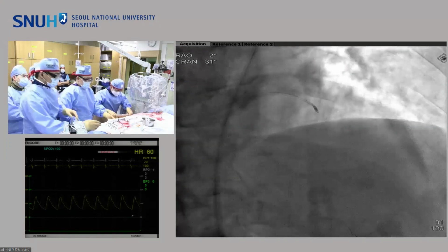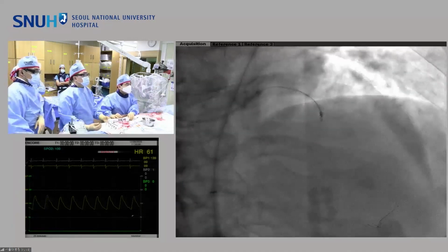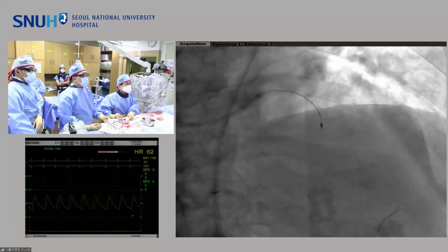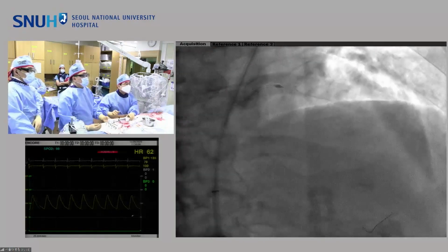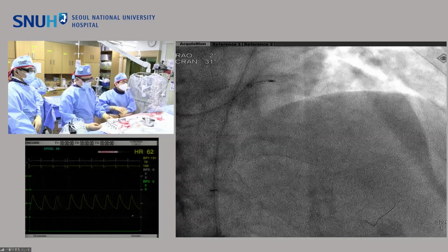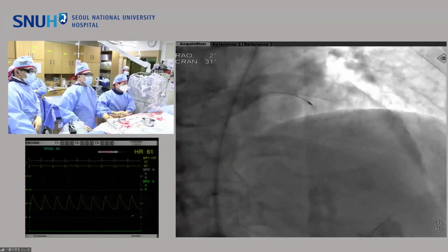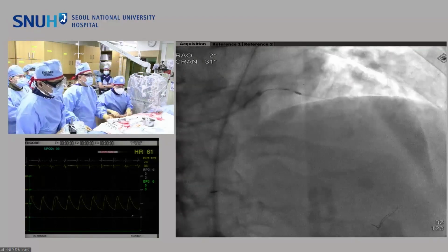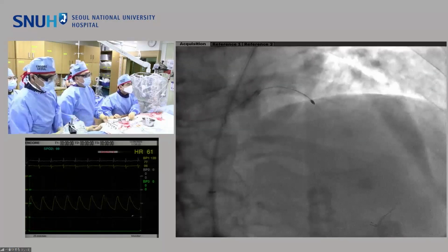Okay, I once again ablate the lesion, maximum speed. Okay, then I try to reduce the number of RPM down to 150,000. This is Japanese style. Slow. This is new to me. I never did this.